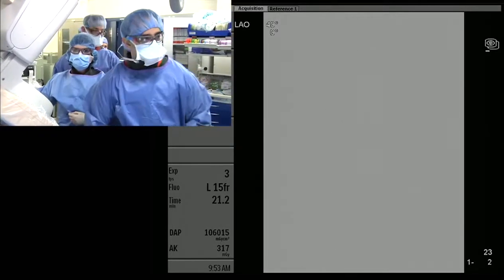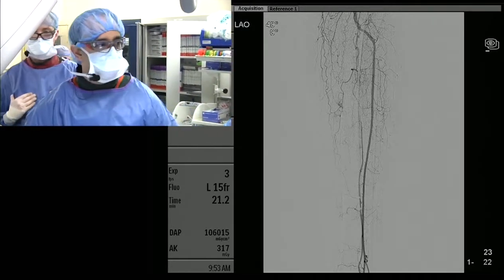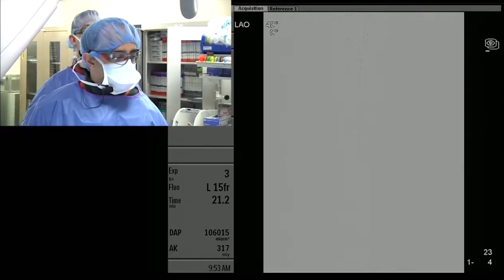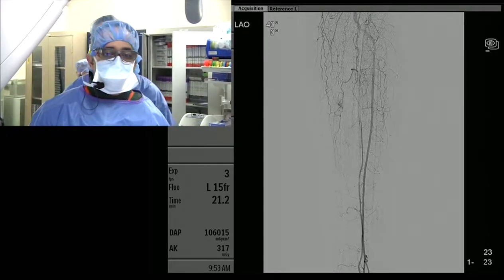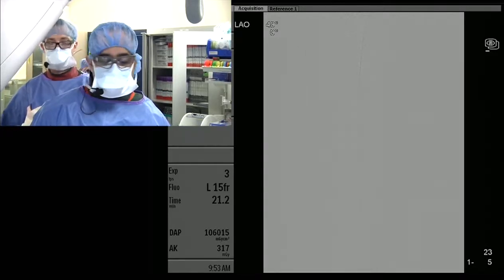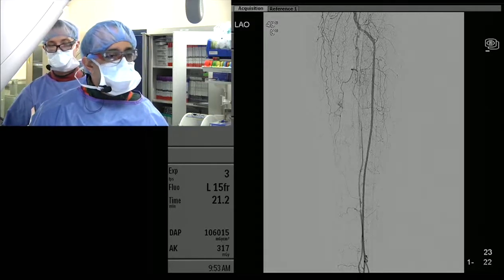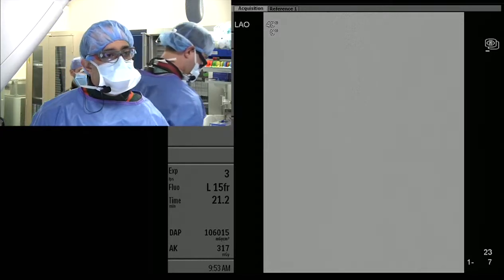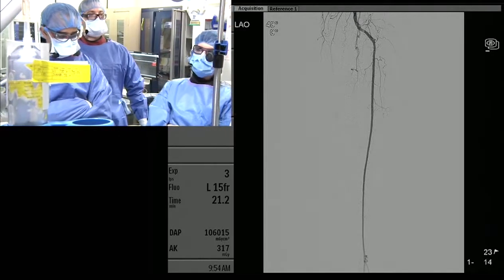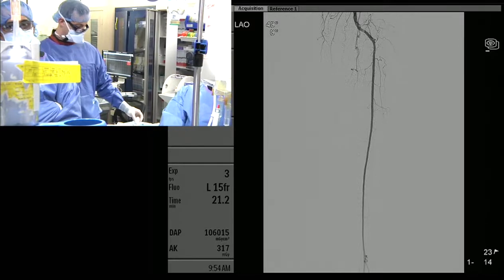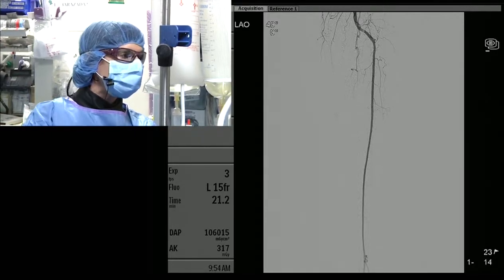You can see the difficulties we used to have doing PAD cases this way. This afternoon with the sheath it should go a little bit smoother — the destination sheath just released about a month and a half to two months ago. Even with the sheath, we still have issues with wire length — you only have 300-centimeter wires and 180 to 200-centimeter balloon shafts. We switched to the V18, and the 0.014 and 0.018 wires are the only ones compatible for the R2P 300.